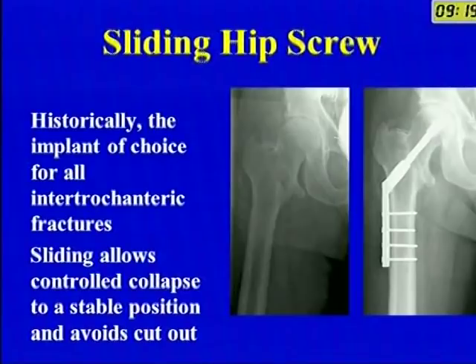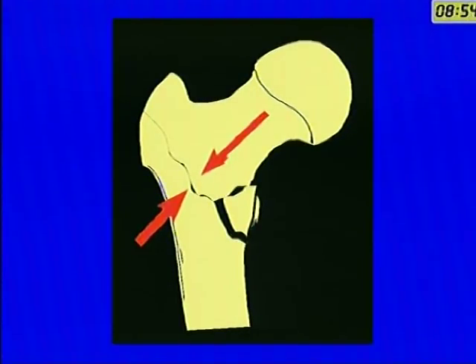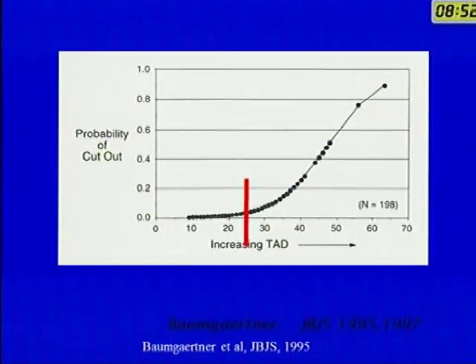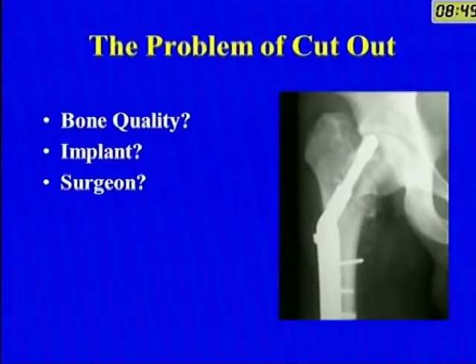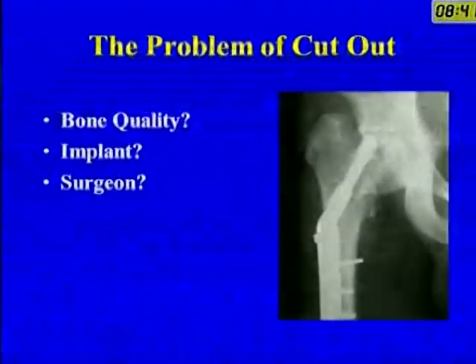So the sliding hip screw, historically, for all of you who are doing post-graduation now, is the only implant that you know for the treatment of intertrochanteric fractures, and it was a successor to the Jewett fixed nail plate device. So the sliding allows for a controlled collapse, allowing your fracture surfaces to come together and avoiding or minimizing the chance of penetration of the implant.